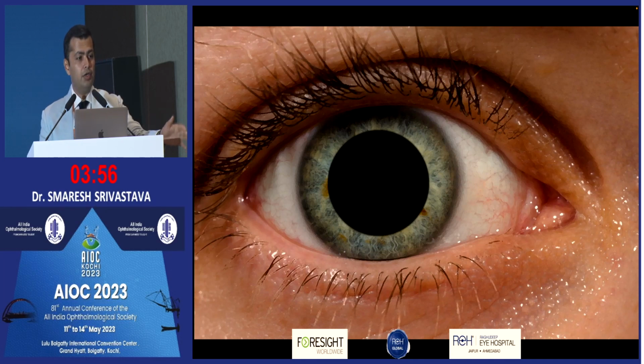All your tests, including your autorefractors and topographies and aberrometry, should be done in a dark room, a mesopic room, because that's the challenge. Because patients will come to you complaining, saying, "Raat ko nahi dikhta hai." Daytime, most of these people will not have problems because the pupil dilates and it becomes irregular. So it's good to document everything in dim lighting conditions.